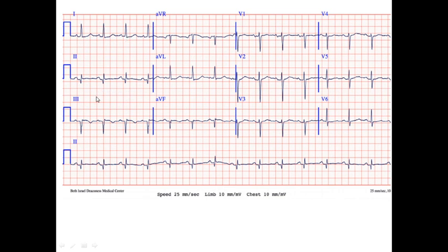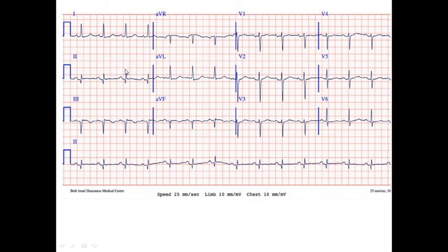Let's also calculate the heart rate. For this we should know the speed — the speed is 25 mm per second. If our speed is 25 mm per second, the duration of our big box is 0.2 seconds. You can see there are 3.5 big boxes between the two RR complexes. Using the simple formula: 300 divided by 3.5 big boxes gives us 85 beats per minute. We should also assess the axis of the heart.